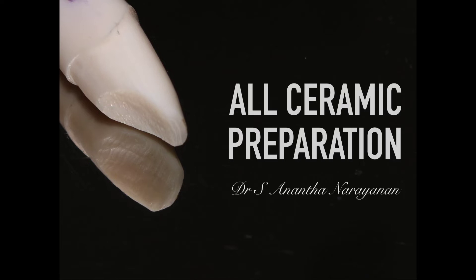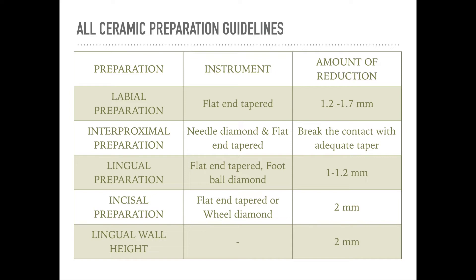Before we begin with the preparation, there are certain guidelines regarding the amount of reduction on each aspect of the tooth. The labial reduction ranges between 1.2 to 1.7 mm, whereas the interproximal reduction is just to break the contact and provide adequate taper. The labial reduction varies because 1.2 mm is sufficient at the cervical margin where the tooth portion is narrower, whereas 1.7 mm is adequate at the incisal portion. For the lingual preparation, a reduction of about 1 to 1.2 mm should be sufficient.